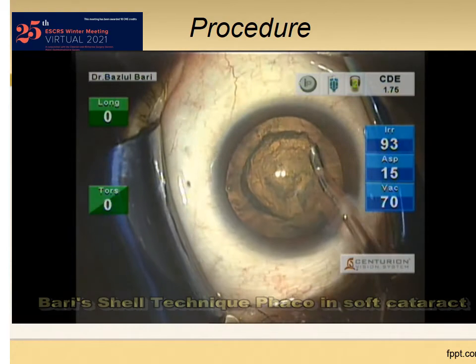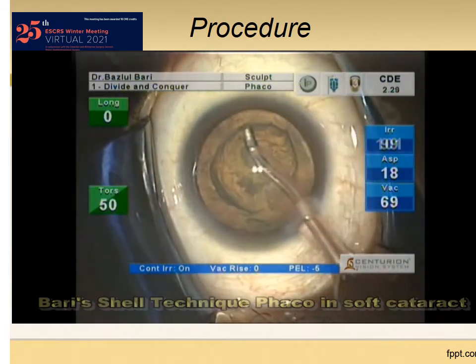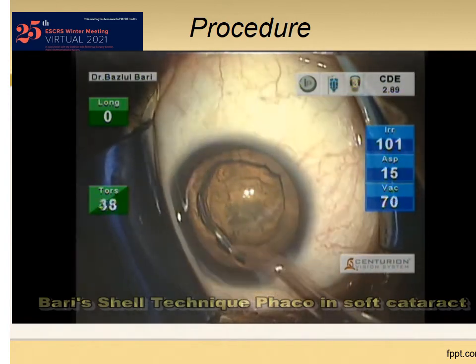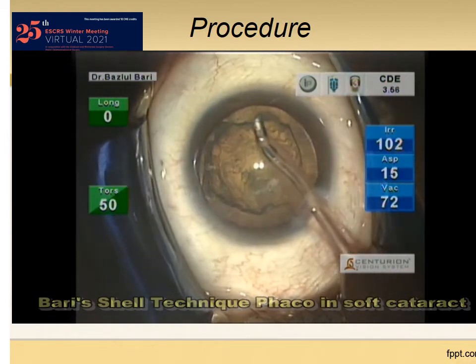This part helps in two ways. One: true hydro delineation can be performed to create a shell posteriorly. Two: the core nucleus gets enough room to prolapse, which we will see later on.